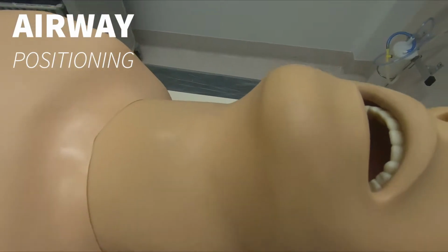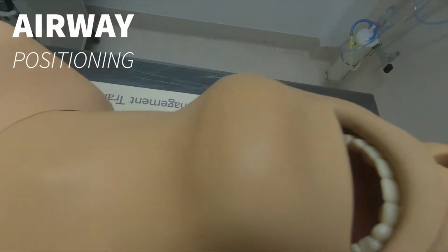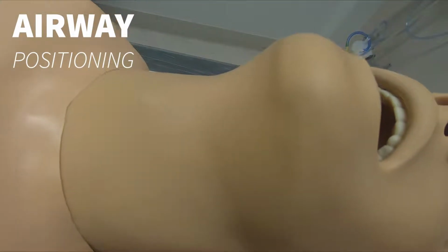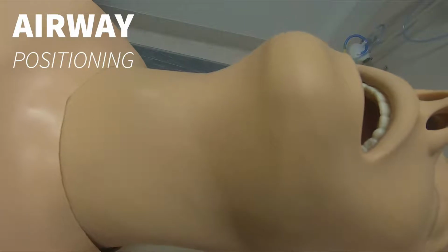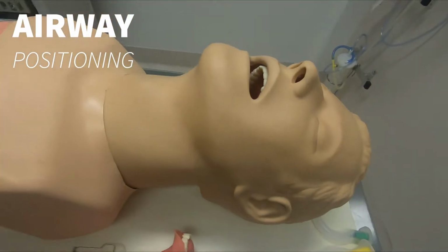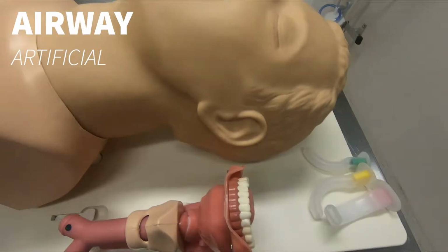This is hard to do with one hand on this hard model. The thyromental distance becomes larger, and this bend will flatten out, making it much easier to circumnavigate the epiglottis and manage the airway. So these are positioning strategies, but we can also use adjuncts.